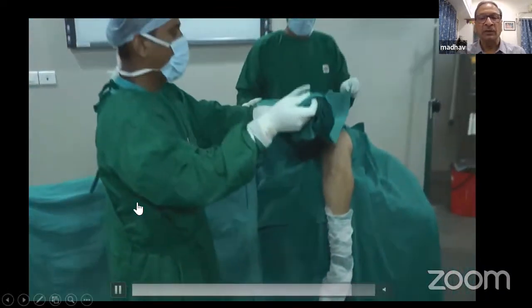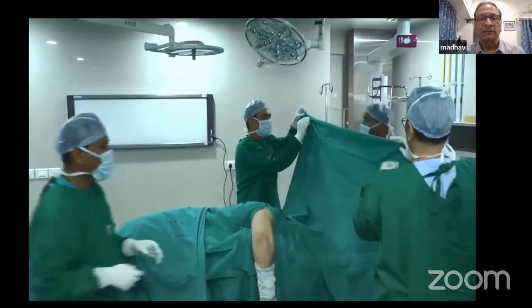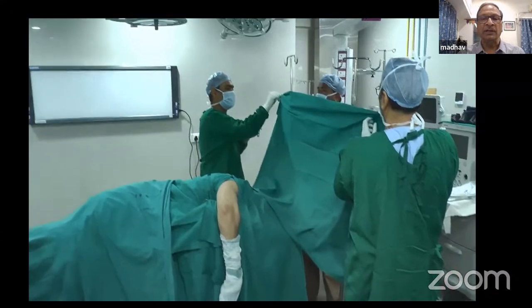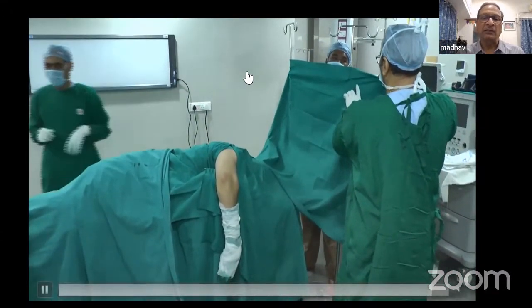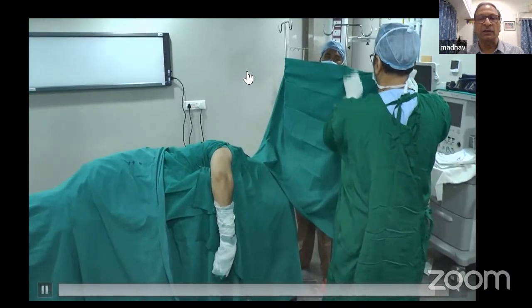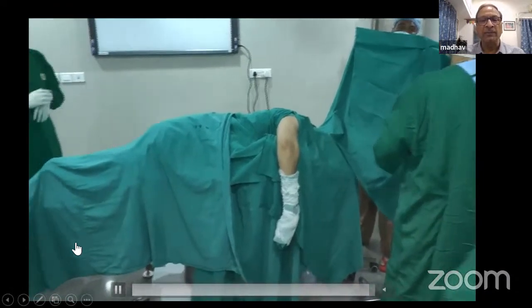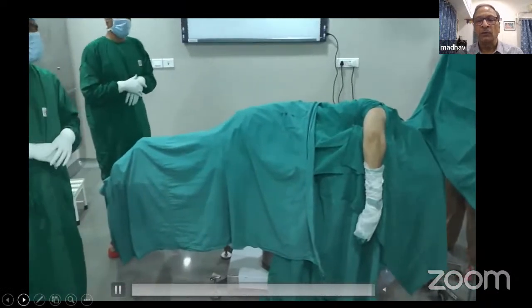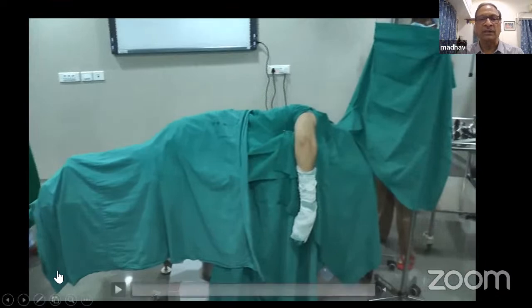So the hand is now resting on the armrest, completely draped and isolated. There goes the anesthesia screen, which isolates the head end and the anesthesia trolley from your operating field. So that is the way you ideally drape for the arm and forearm, upper third forearm and elbow, for a posterior approach.